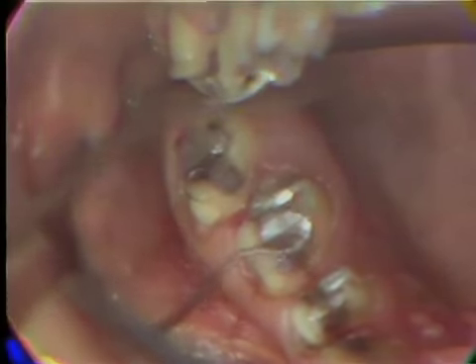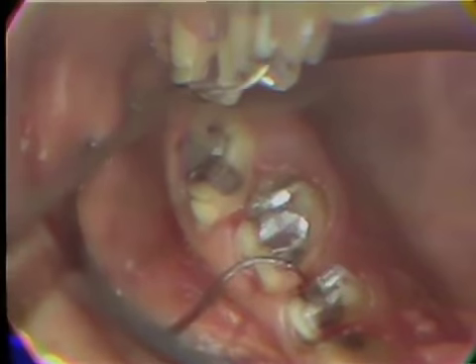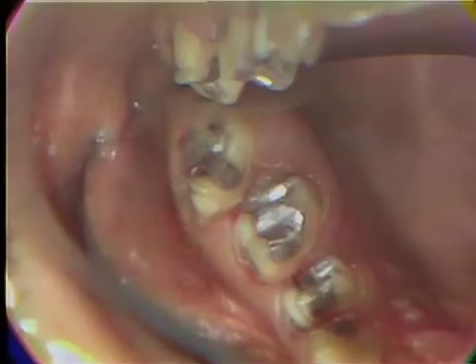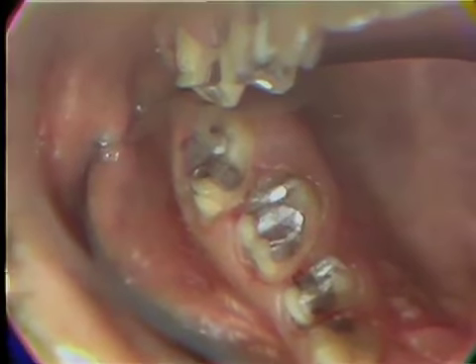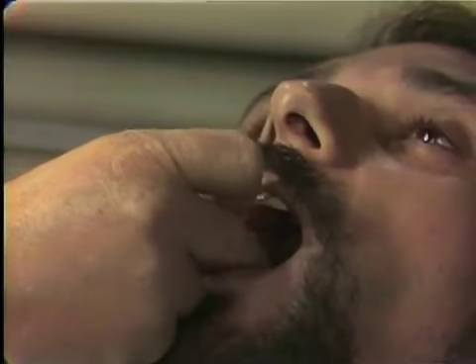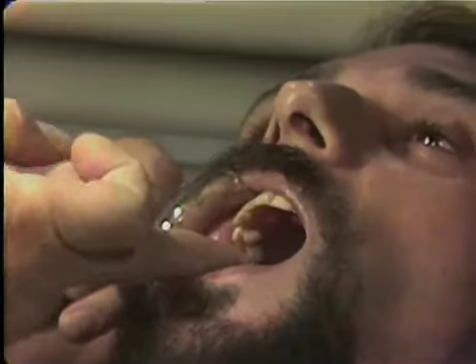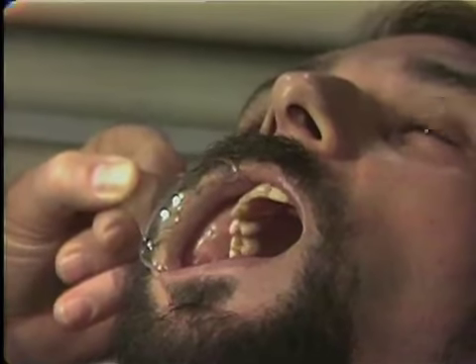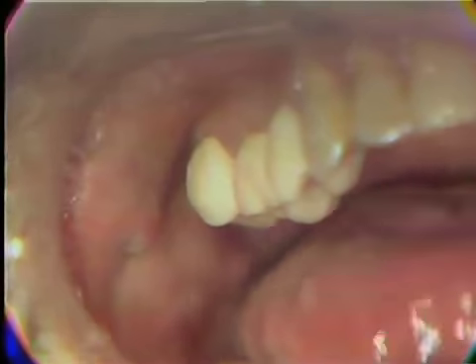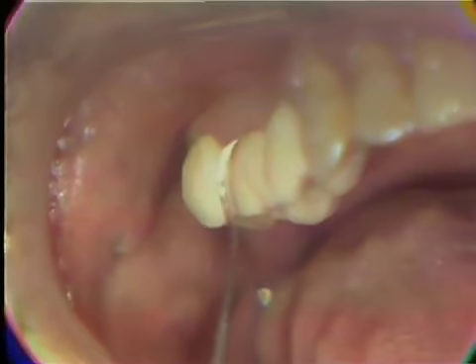You can see the area between the bicuspid and the molar. The tissue looks fairly good. So it's important to keep that tissue in a healthy state. Then the margins of the temporary are important. Again, if they're overextended, they can cause some tissue problems.